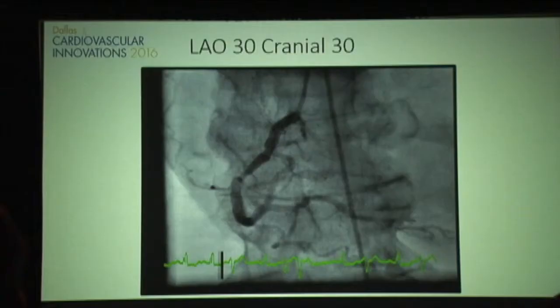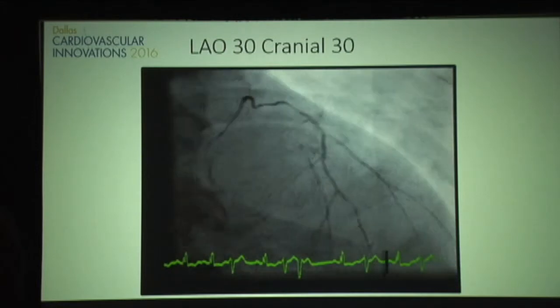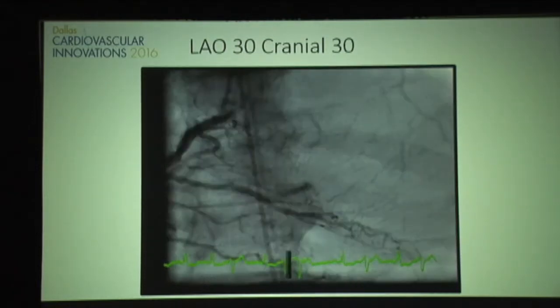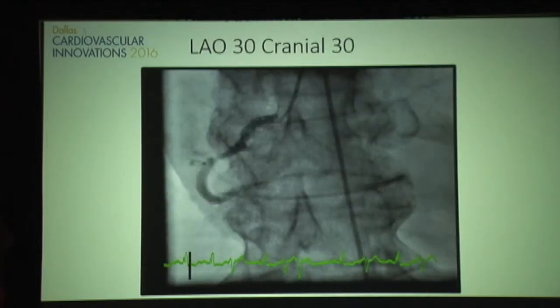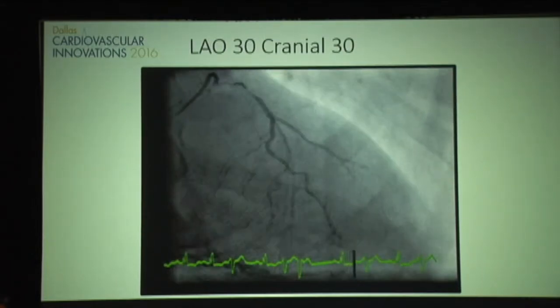Showing these really to be very fine targets, although the diagnostic physician didn't do dual access and contralateral injections. We'll show some pictures of that in a minute, and the value of that. I know we'll talk about that more in the CTO sections tomorrow. You get the idea from the pictures here that these occlusions weren't necessarily that long, even though they were complete. Okay, so there we are, an ugly picture of the left, with lots of collateralization.